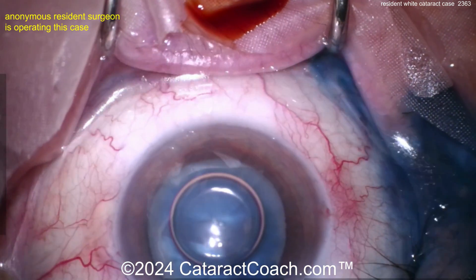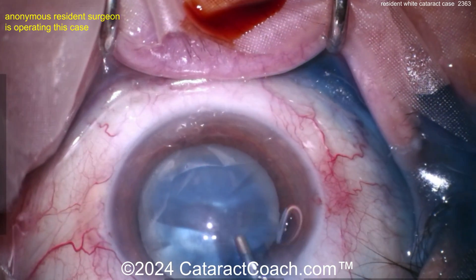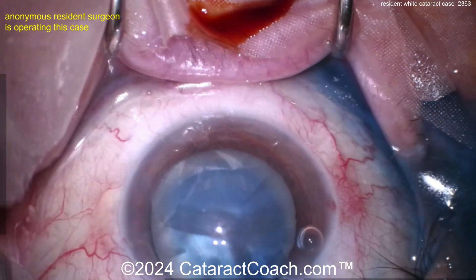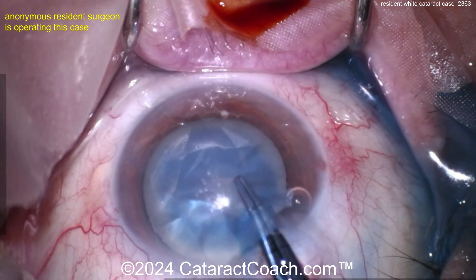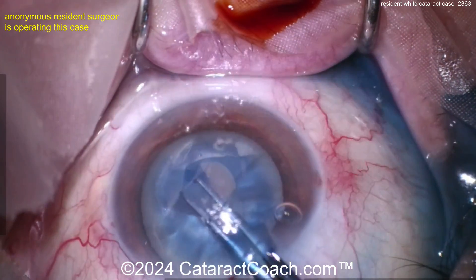For a white cataract, especially one with good nuclear density, you don't want a baby rexis — you want a good-size rexis. If you're doing a double rexis technique, sure, make a baby rexis to decompress the capsule and then enlarge it. But you don't want to end up with a baby rexis, and from the title slide you already know we're going to end up with a bit of a small one.